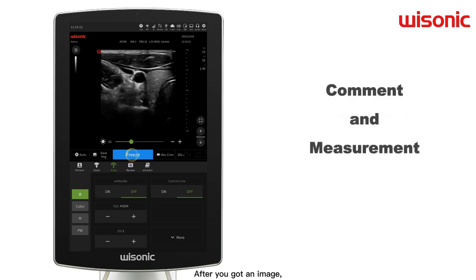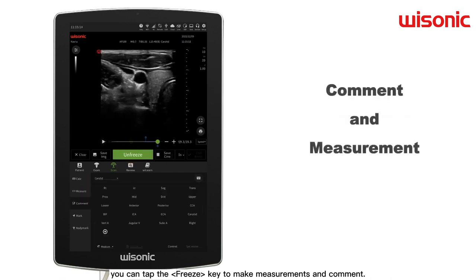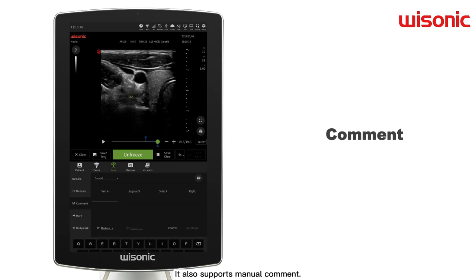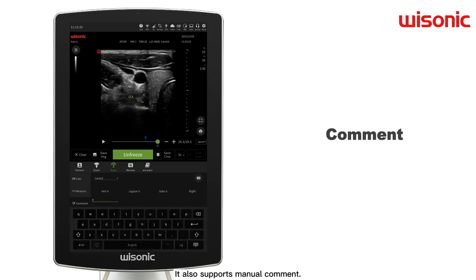After you get an image, you can tap the freeze key to make measurements and comments. To make a comment, press the comment key. The comment package can be chosen according to presets. It also supports manual comment.